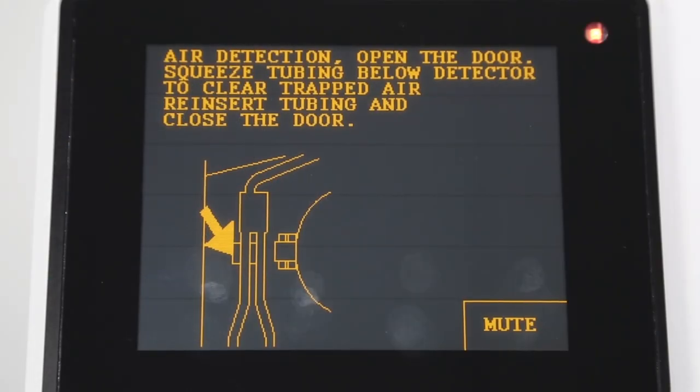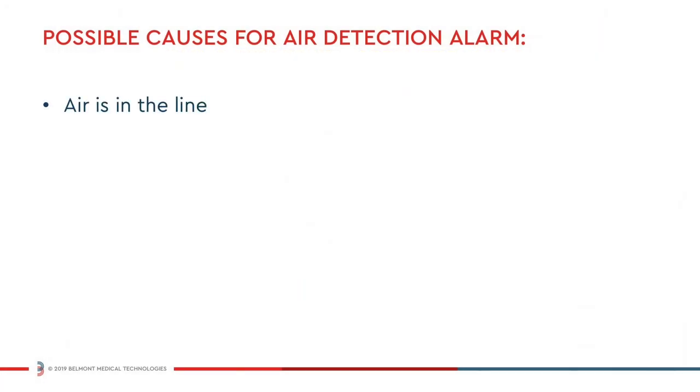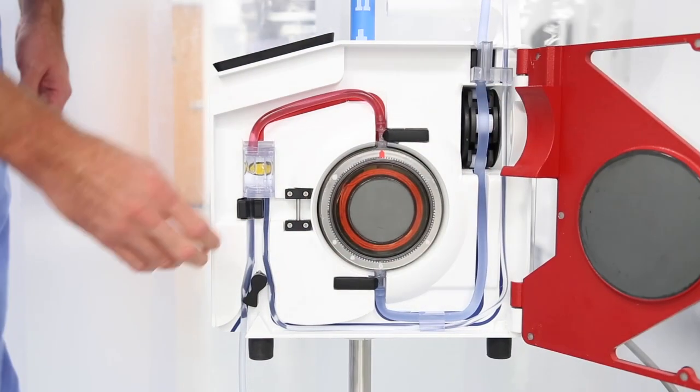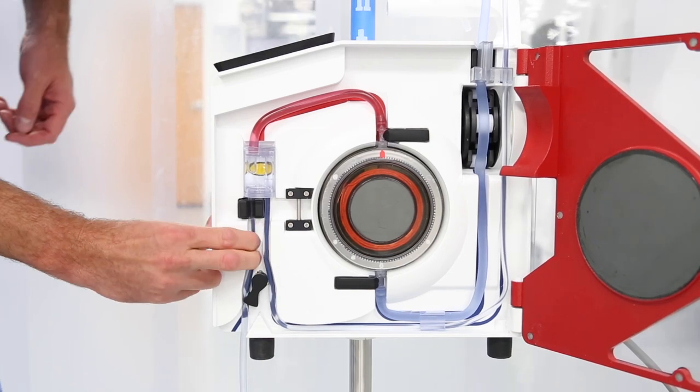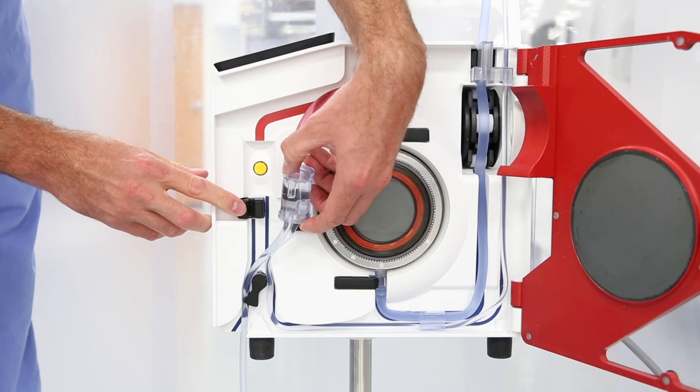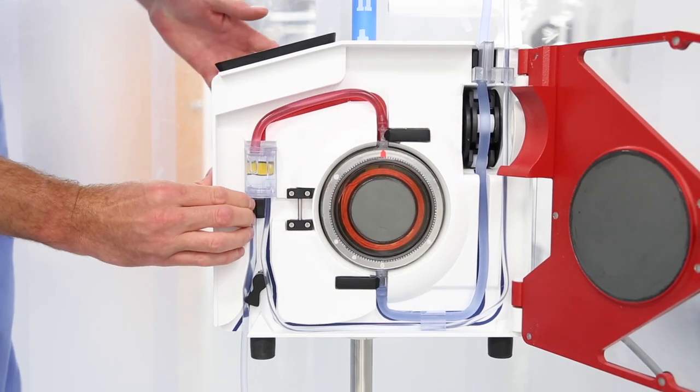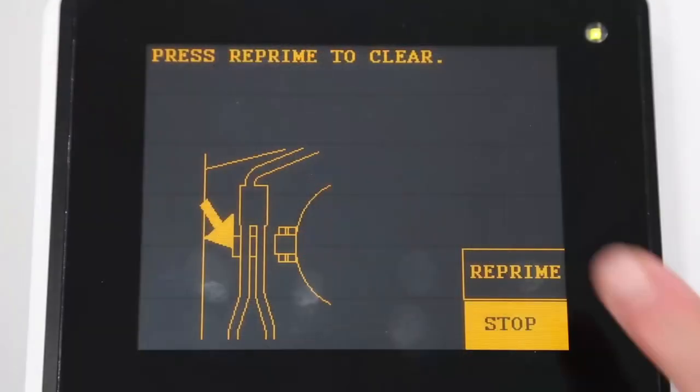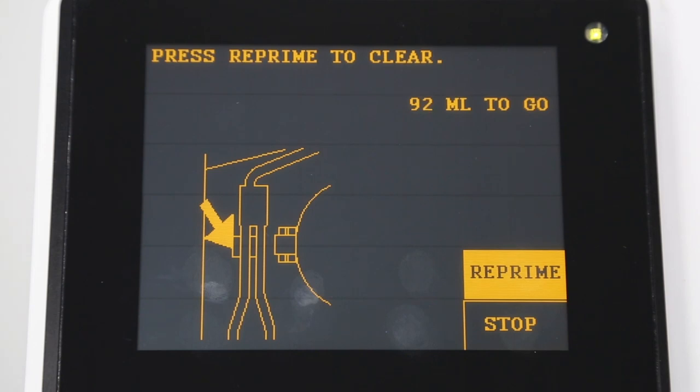The air detection alarm would be triggered if air is in the line, the secondary air detection sensor is not firmly seated, or if the air detector sensor is dirty. First open the door to silence the alarm. Squeeze the tubing directly below the air detector to clear any trapped air out of the sensor. Check the air detector and make sure that it is clean and the infuse line is properly seated inside the air detector. Finally, press reprime. The system will resume infusion when the repriming process is complete.